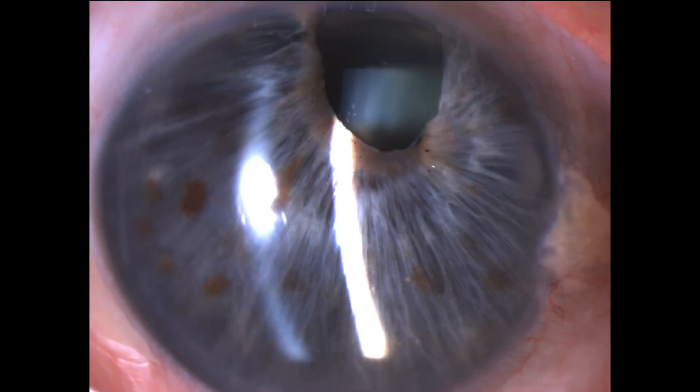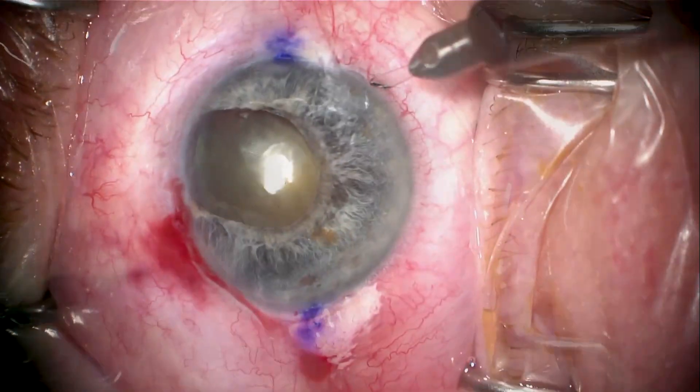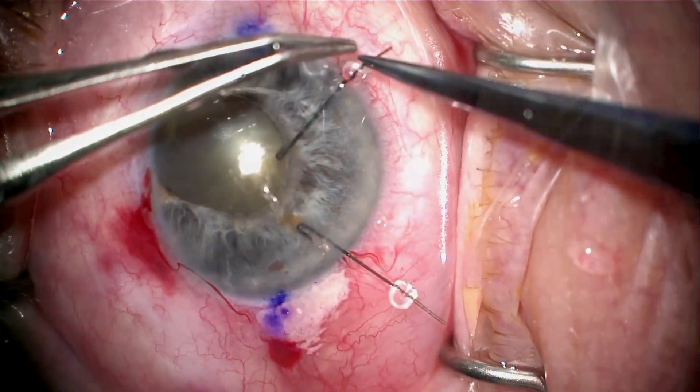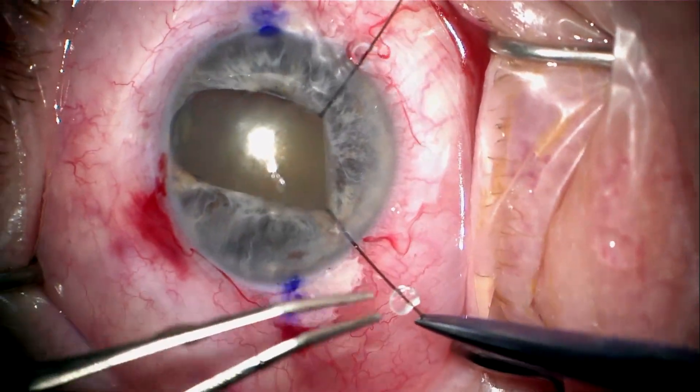This is a patient who had trauma to his right eye many decades earlier. He has a dislocated pupil, a dense cataract, and his vision is count fingers. He also has a low endothelial cell count around 600, so we want to try to preserve his endothelial cells.